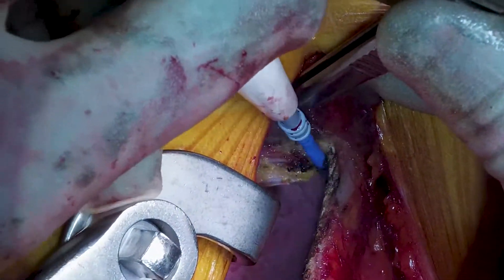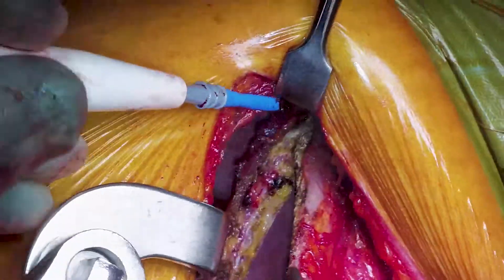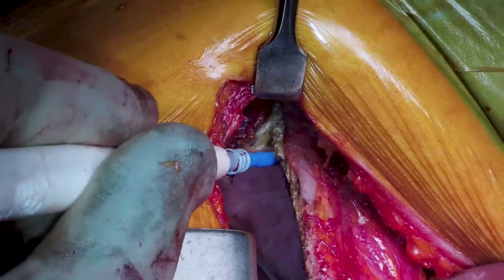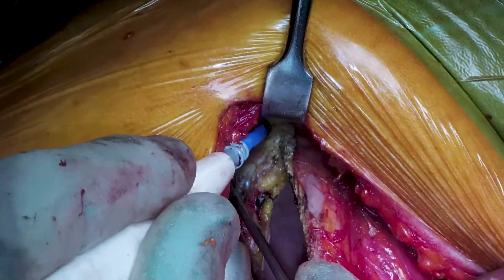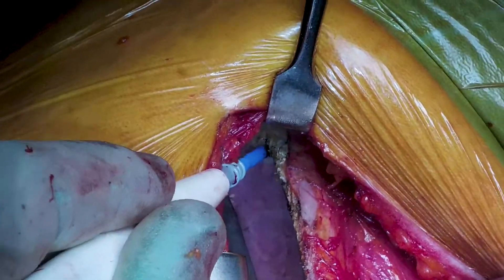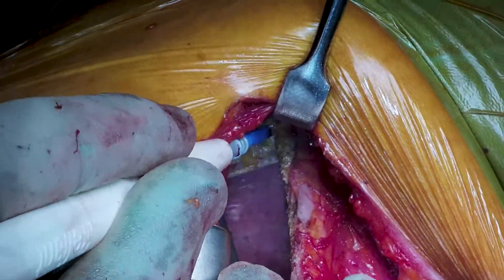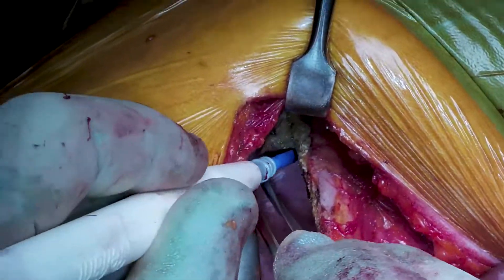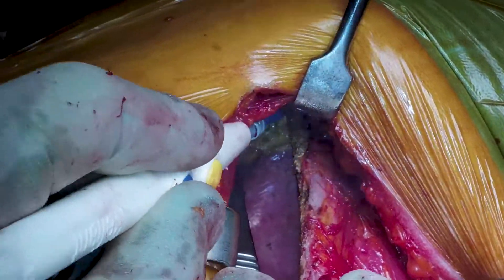Hopefully this has been informative for performing an anterolateral thoracotomy in an elective setting. The intercostal strip was a point Mr. Dunning really wanted to stress — it only takes a few extra minutes but is really important for post-operative pain, and has been proven beneficial in multiple randomized controlled trials. Hopefully you'll want to watch the second part of the video where we actually remove the lung cancer.